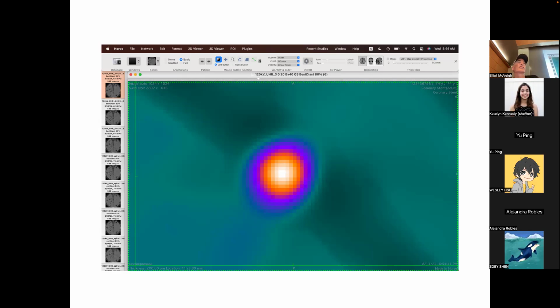Okay, so the question there is, does the resolution depend on the number of photons that you have used to make your picture? This is a two-stage answer. No is the first, because the photon's going to hit a detector, and the resolution is basically dependent on the dimension of the detector, right? So whether it hits the top left corner, the bottom left corner, or whatever, all the photons will go in there. The problem is when you're making a CT image, if you don't get enough photons in each detector, then the manufacturer starts to average things together to make it smoother, because otherwise it's very noisy. And so that averaging makes your effective detector size get bigger and the resolution goes down. So that's a two-stage thing.